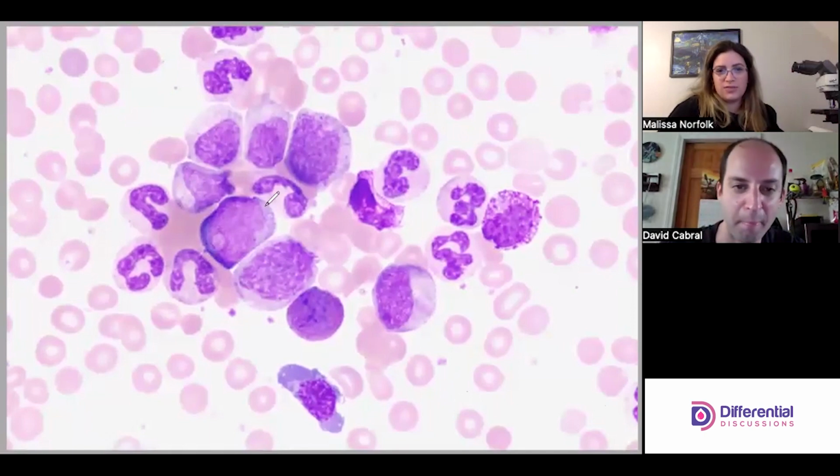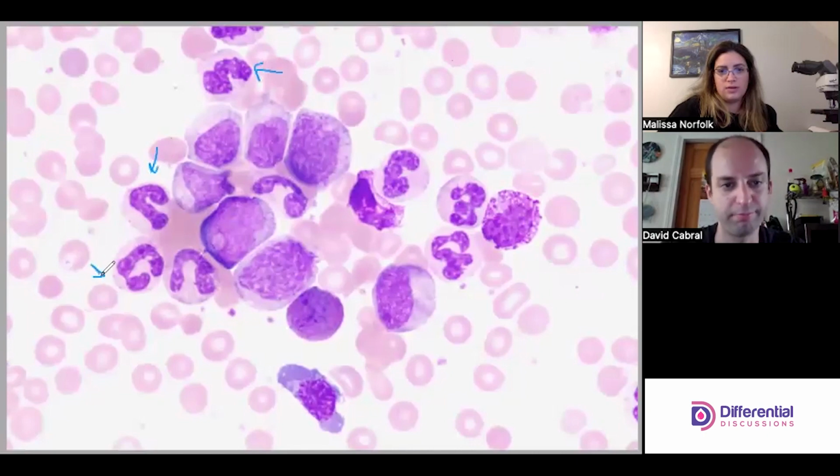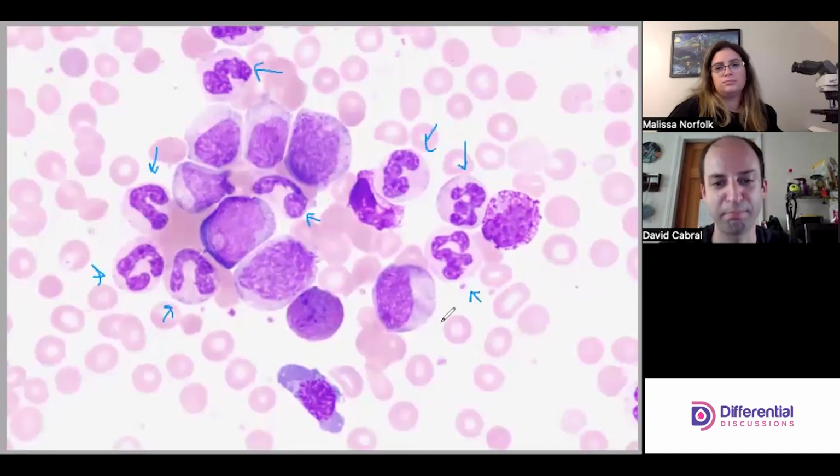Well, I wanted to come to this field because of this beauty. That is a good cell. There's good ones here. So let's point out the neutrophils first, I guess, again, right? Agreed. So we've got one here. Here. Here. No, this one squished in the middle there. Yep, 100% agree. Okay, so we got all the neutrophils.